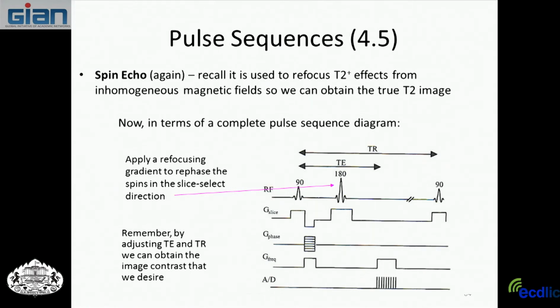This can also be done for a multiple slice tissue. So we'll keep flipping, and we're only actually collecting one line in the phase direction when we're doing this, because you can see we're only turning on our frequency to do a section of the tissue.